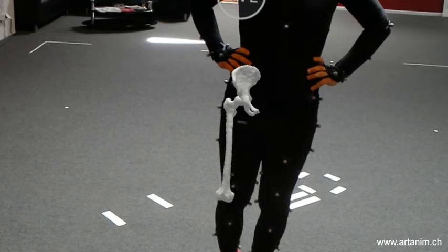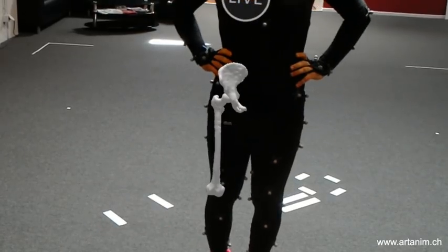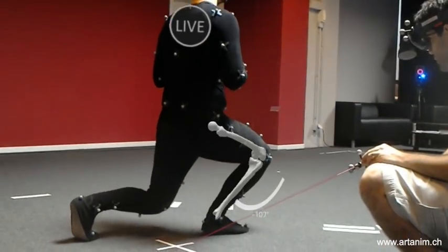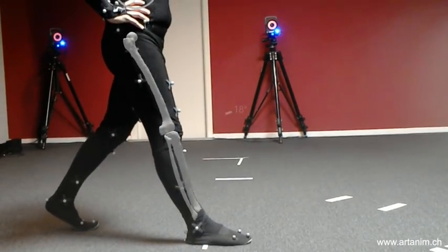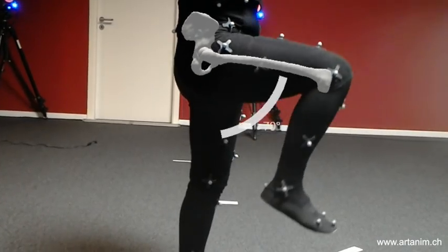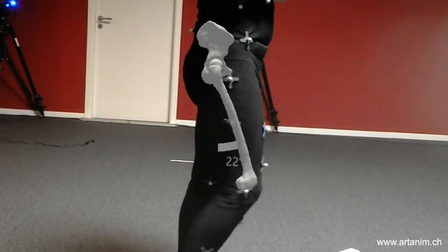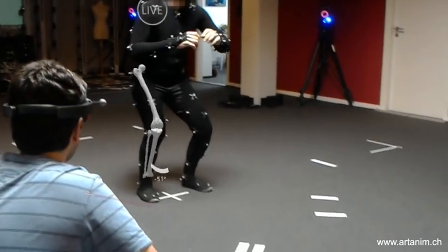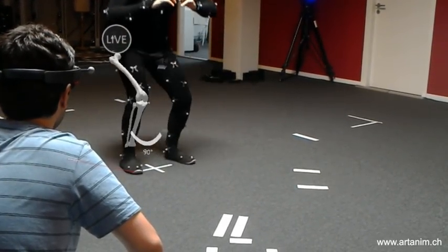In the context of physical rehabilitation, the practitioner can observe the current range of motion of the treated joint during typical rehabilitation exercises. By recording personalized videos, results from previous physiotherapy sessions can be compared to evaluate the patient's progress in terms of kinematics.